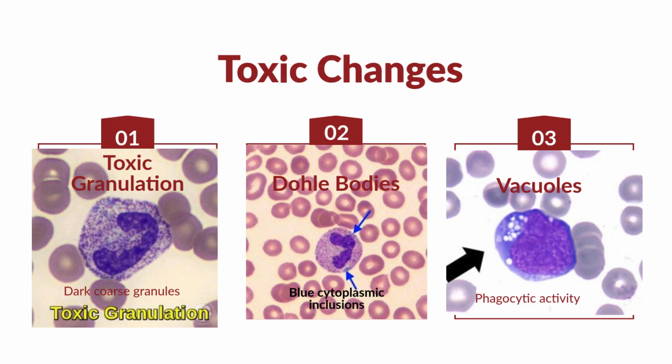Toxic changes are usually reactive, a reaction to a marrow response. And blasts are malignant, concerning, immature, and abnormal. Should not be getting those at all. In the left shift connection, toxic changes are often seen with a left shift. That means increased bands, immature granulocytes, active marrow response. Remember, neutrophils are the foot soldiers. They are regular police patrolling the area.